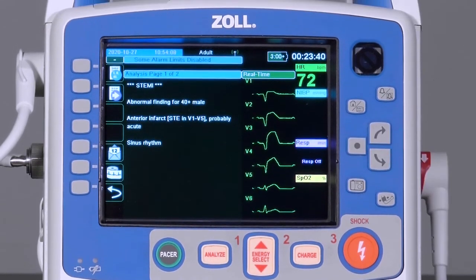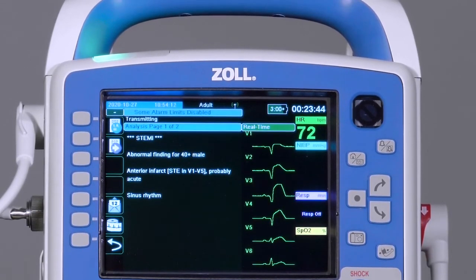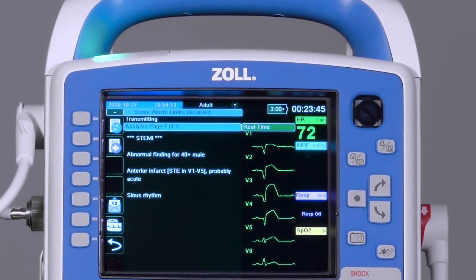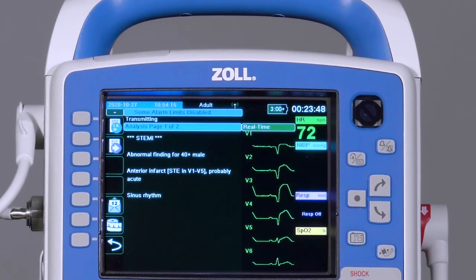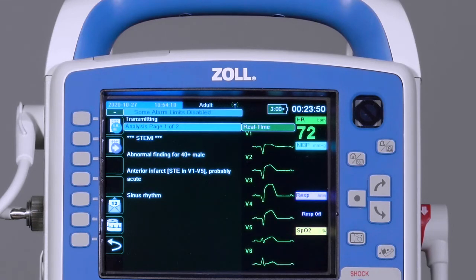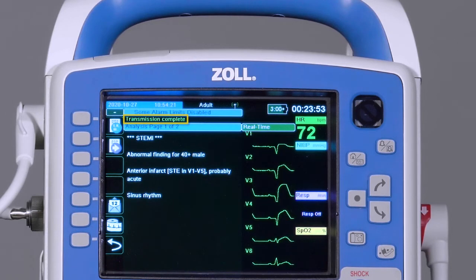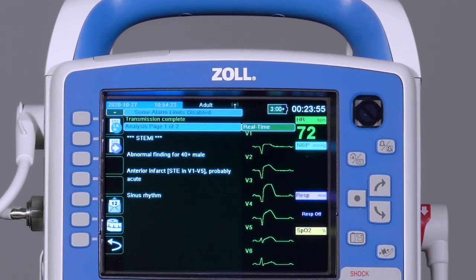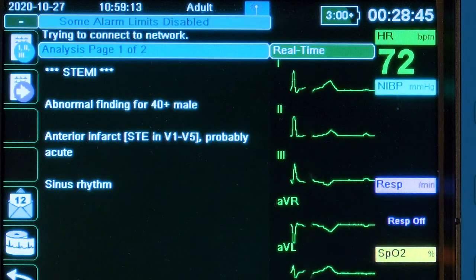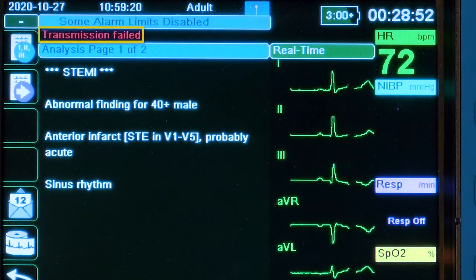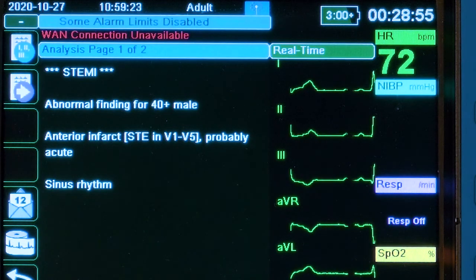The transmission process will begin. The green LED light on the top of the X-Series Advanced will illuminate while the device is communicating with the server. If successful, the words 'Transmission complete' will appear in green above the 12-lead snapshot page. If unsuccessful, the words 'Transmission failed' will appear in the same location.